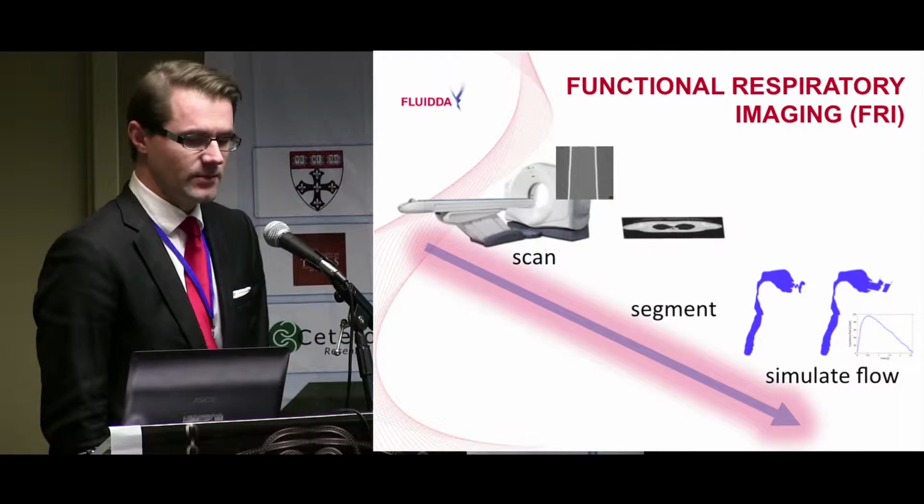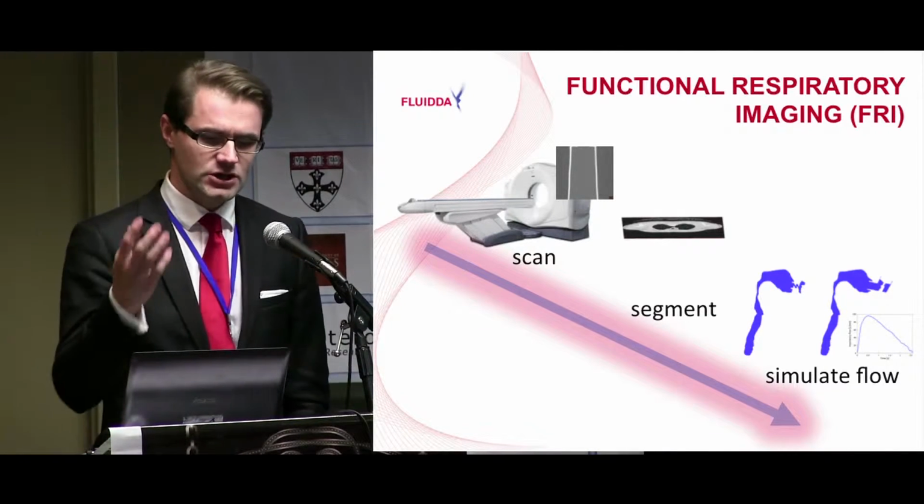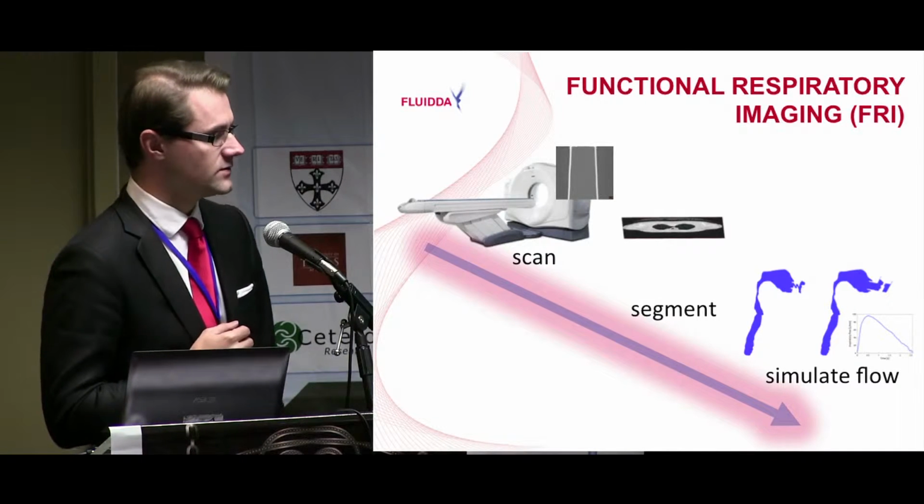What we believe is that by using imaging, and more particularly functional respiratory imaging, we can have more sensitive endpoints, so enhanced sensitivity compared to the pulmonary function test. And of course, if you have more sensitive endpoints, we can reduce the number of patients in those clinical trials. On one hand, to maybe de-risk the very expensive phase 3 trials for innovator products, but also to assess bioequivalence, and that will be the topic of today's talk.